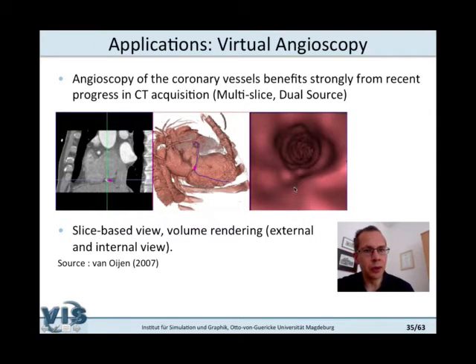Yeah, it only tells you a lot if you see this in the movement, if you have more context, and of course by looking carefully with respect to any abnormalities to be found at the wall. So that was really a quite nice paper. There was a lot of follow-up work, but this topic of virtual angioscopy became widespread based on this publication.